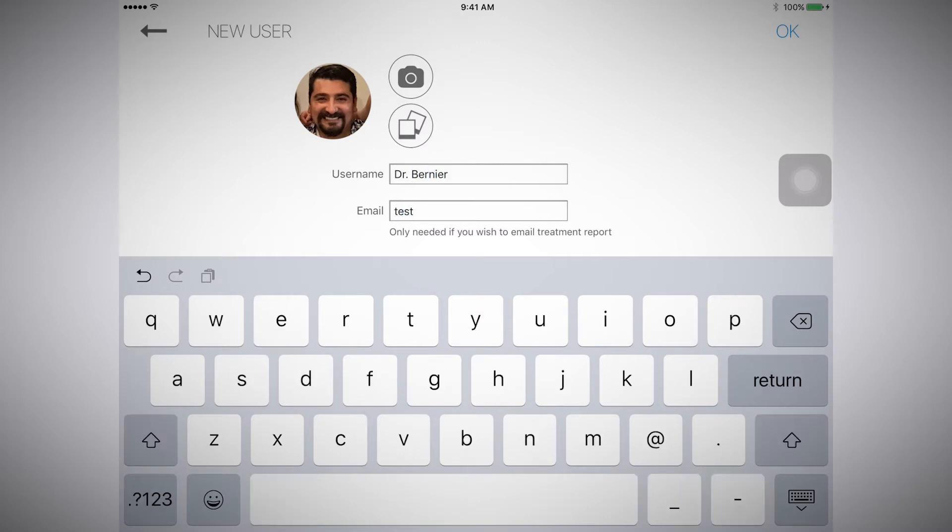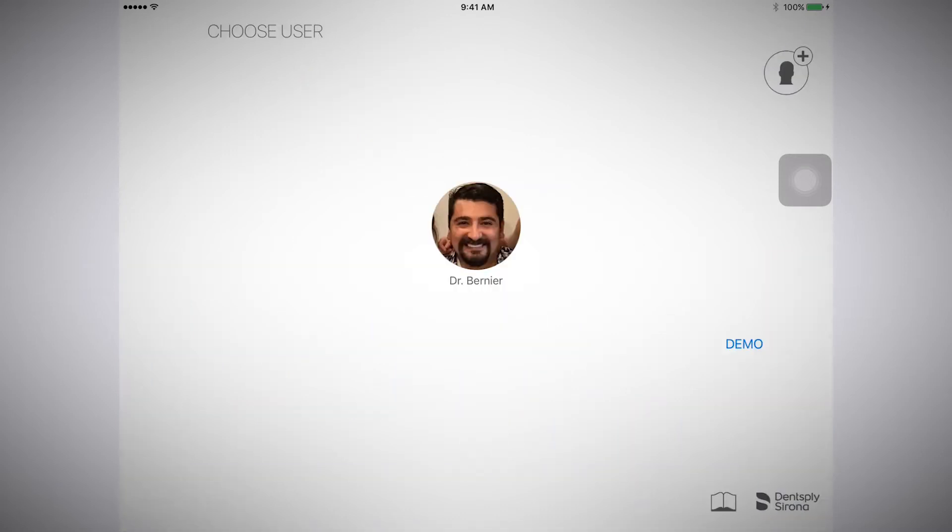You will need to enter an email address if you want the treatment report sent to you. Your user profile will now appear. Select your user profile. Please note that you can have multiple user profiles and you can switch to a different user profile by selecting the current profile image.